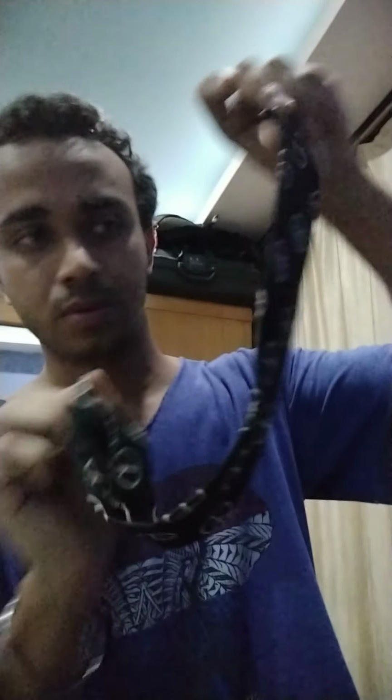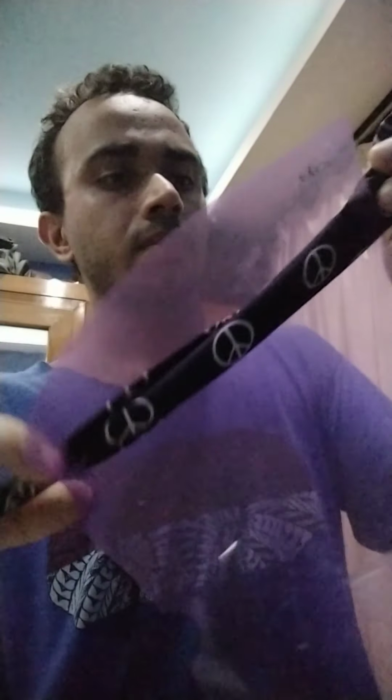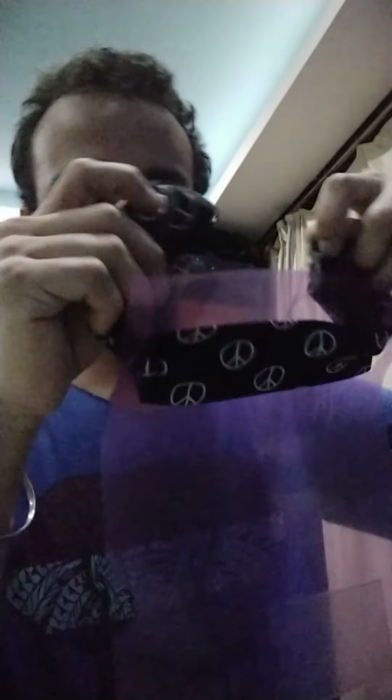After you have cut this like this, all you need is a bandana. Here I have cut this bandana into one piece, and instead of using this bandana, you can also use a hairband or a rope or anything that you think is sufficient to tie this up. So you can just get like this. Here you go. Like this. So after this, you can either use a stapler to staple this up, or you can also use a hook which can be easily detachable.